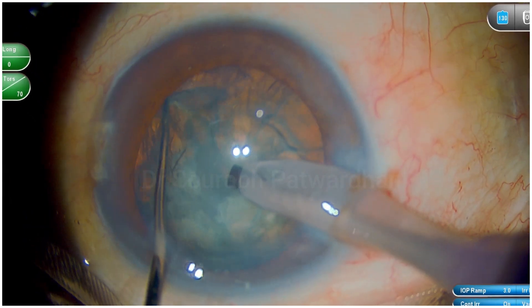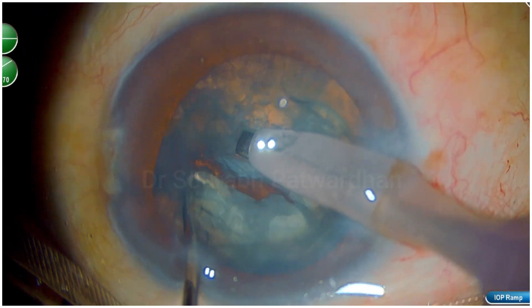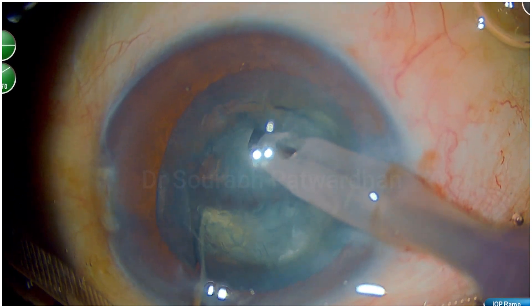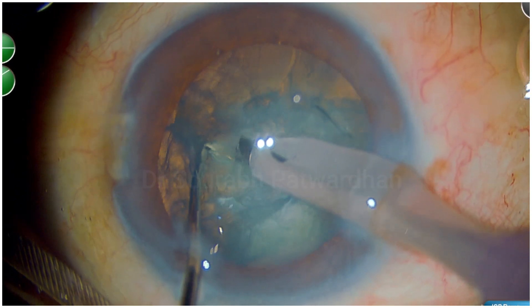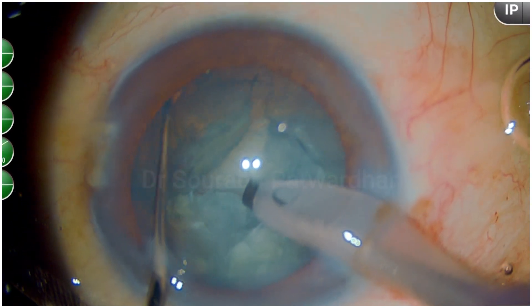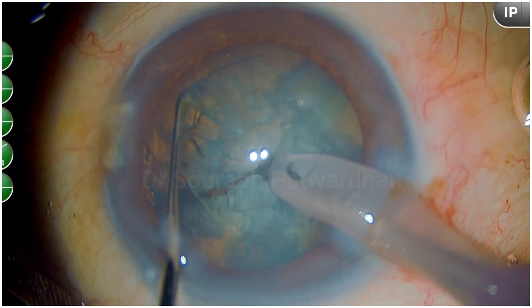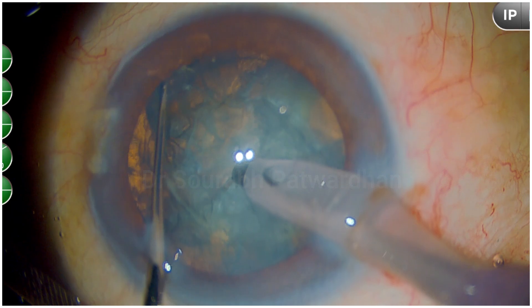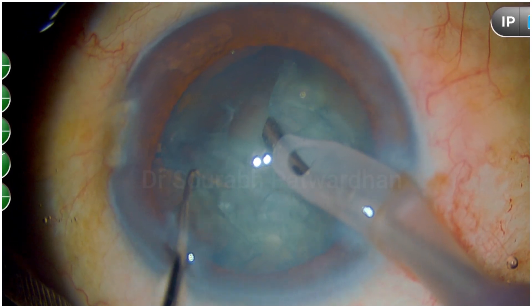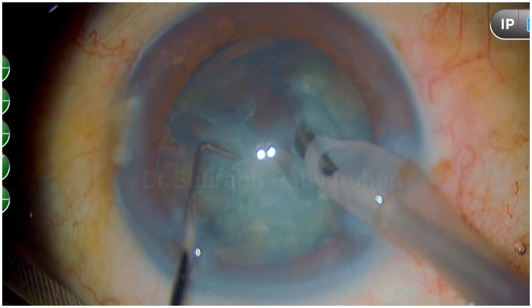You can watch for the third chop — as you go under the capsule and into that space between the cortex and the epinucleus, it also moves the nucleus a bit and presents it in a proper direction in front of the FECO tip. Here you could see that I had resistance, meaning it was not in the right place. Then I placed it in the right place and I could chop the nucleus into pieces.